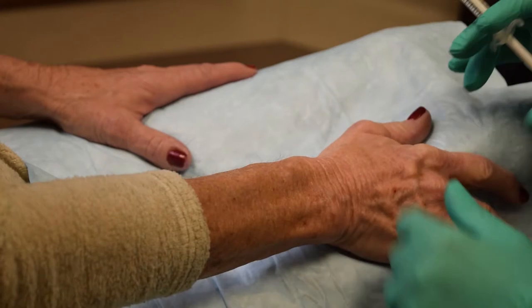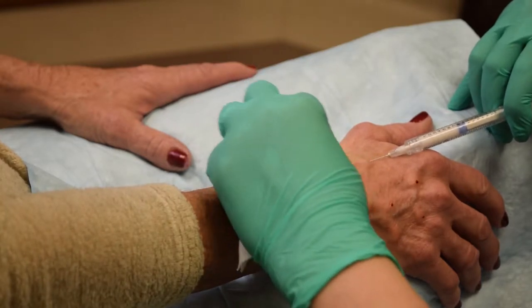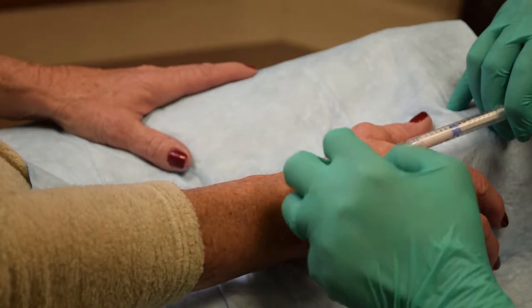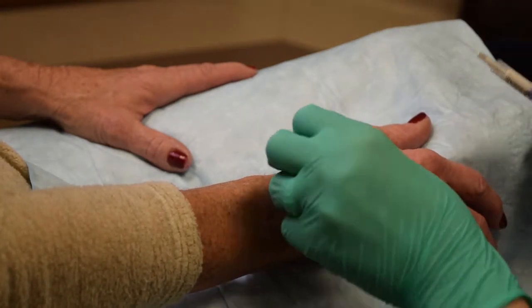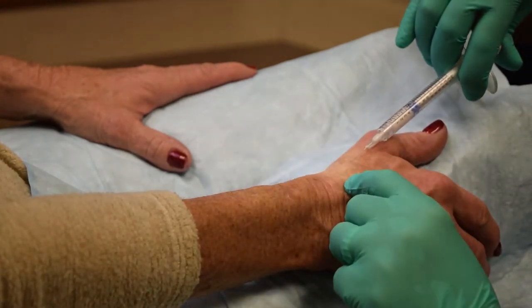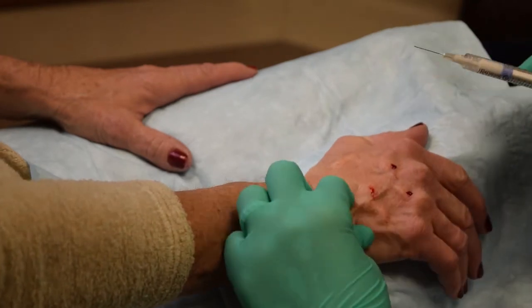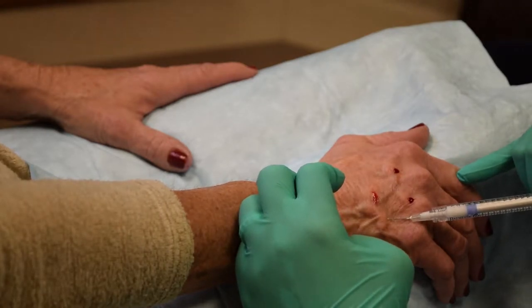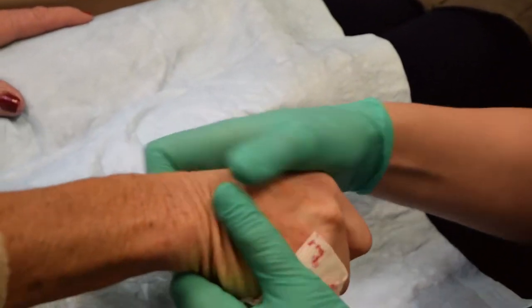Here I'm using a more distal location to correct very prominent MCP joints and get a little bit of filler in between. Injecting closer to the wrist will eliminate the transverse wrinkles that really give away the age. As with any filler injection, I pull back the plunger slightly first and make sure I don't have anything in my bevel. Correction of the anatomical snuff box will really fill up the hand. I used the entire 1.5 cc syringe because of how much atrophy there was.